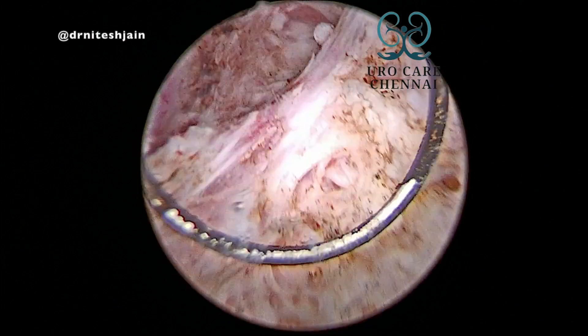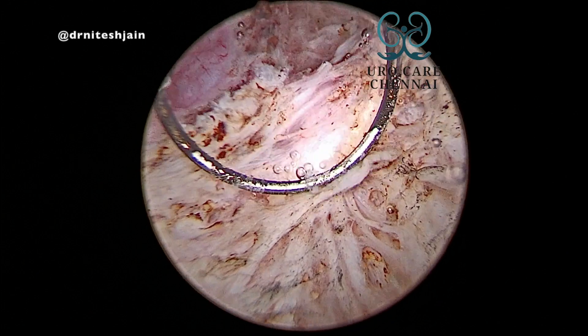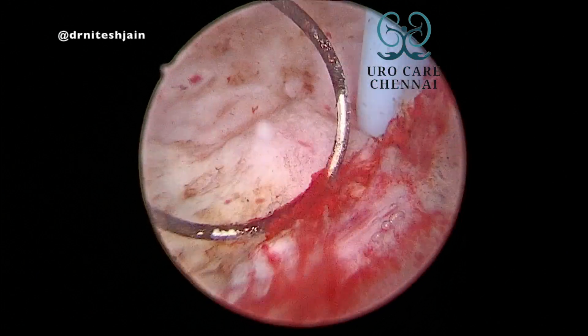The stent can be kept for six weeks and then removed.